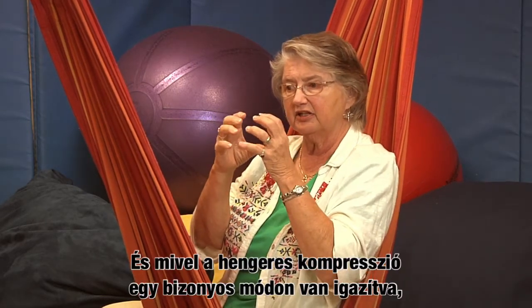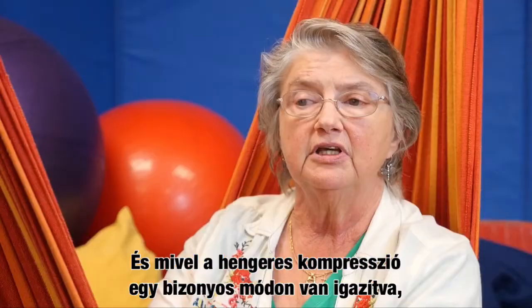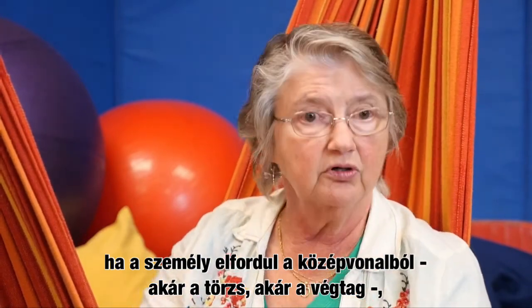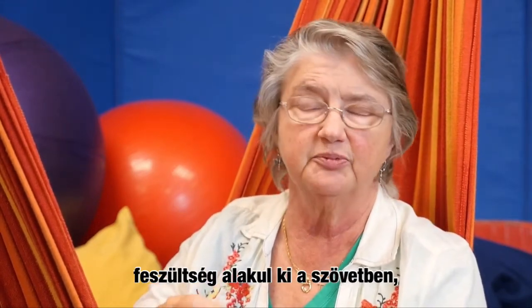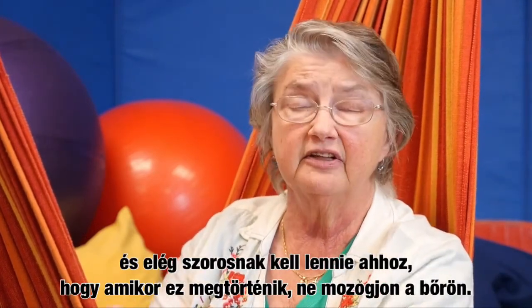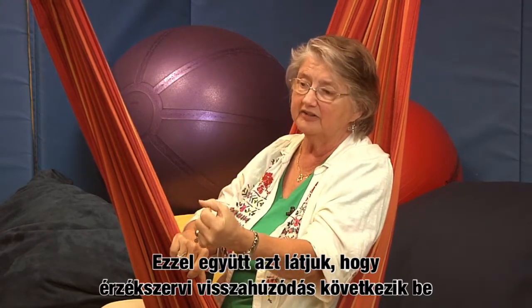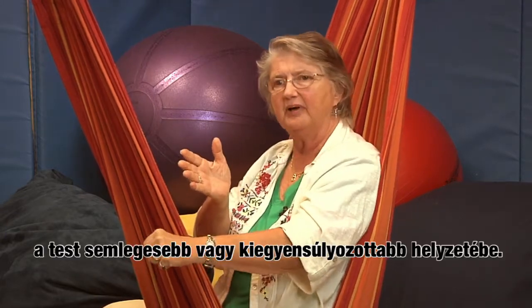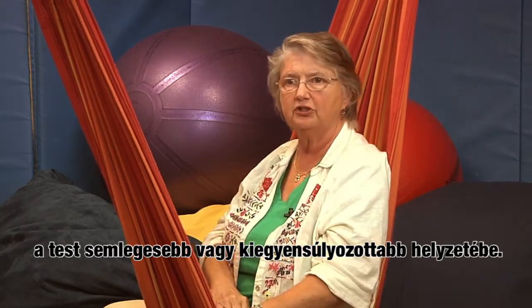And because the cylindrical compression is aligned in a certain way, if the person rotates out of midline, either the trunk or the limb, there is a tension that develops in the fabric, and it has to be tight enough so that it doesn't move on the skin. With that, you see that there is this sensory pull back to a more neutral or balanced position in the body.